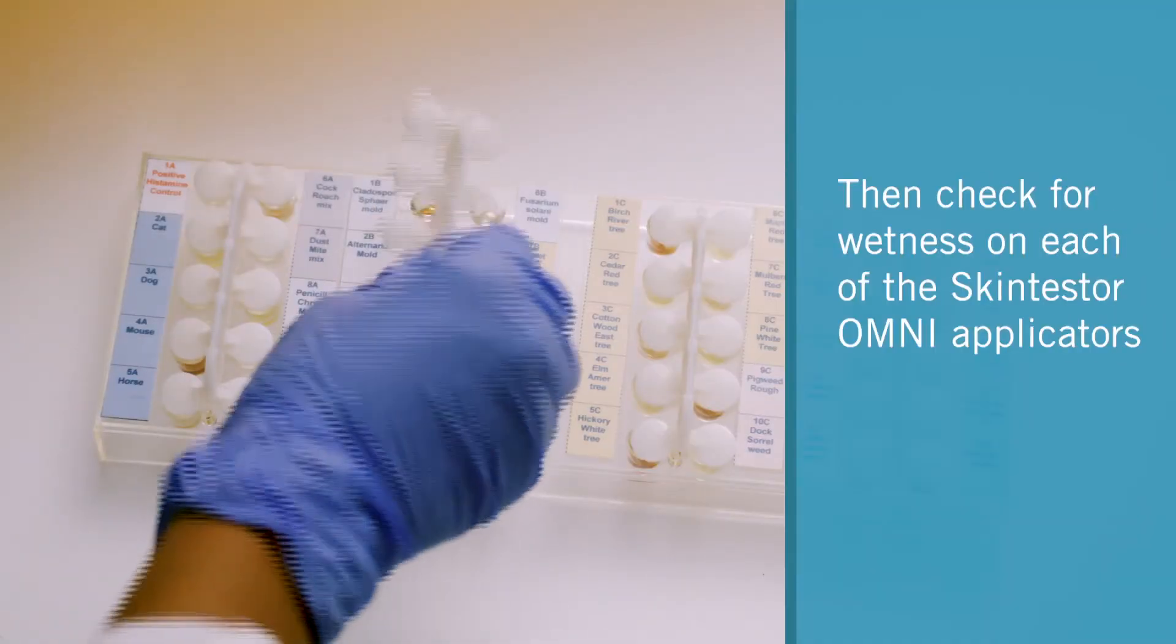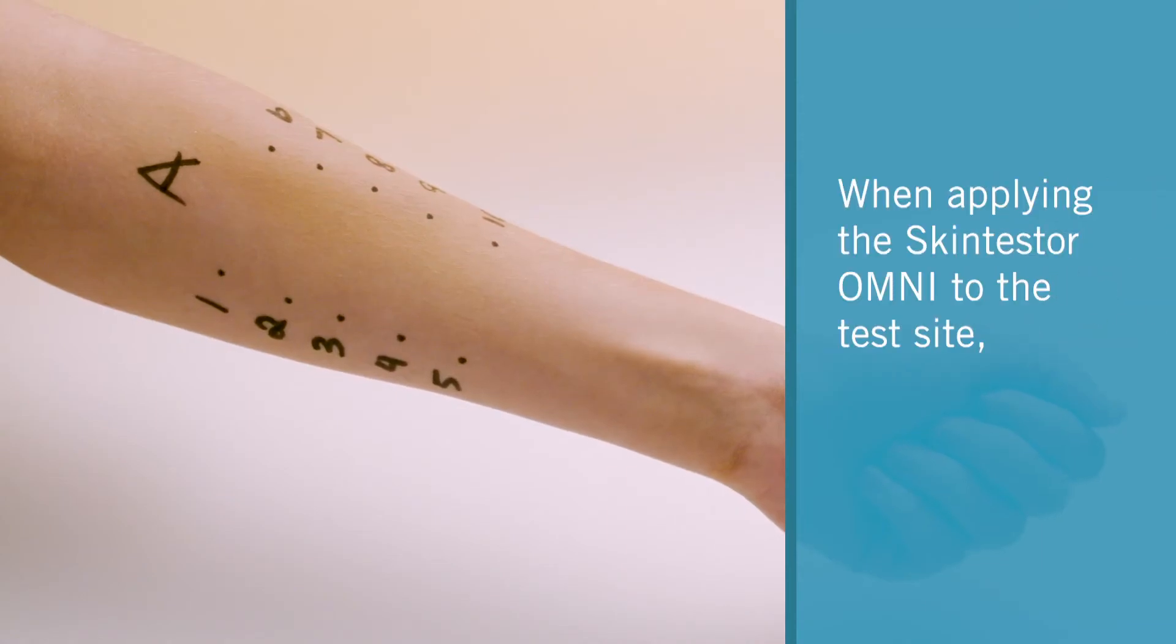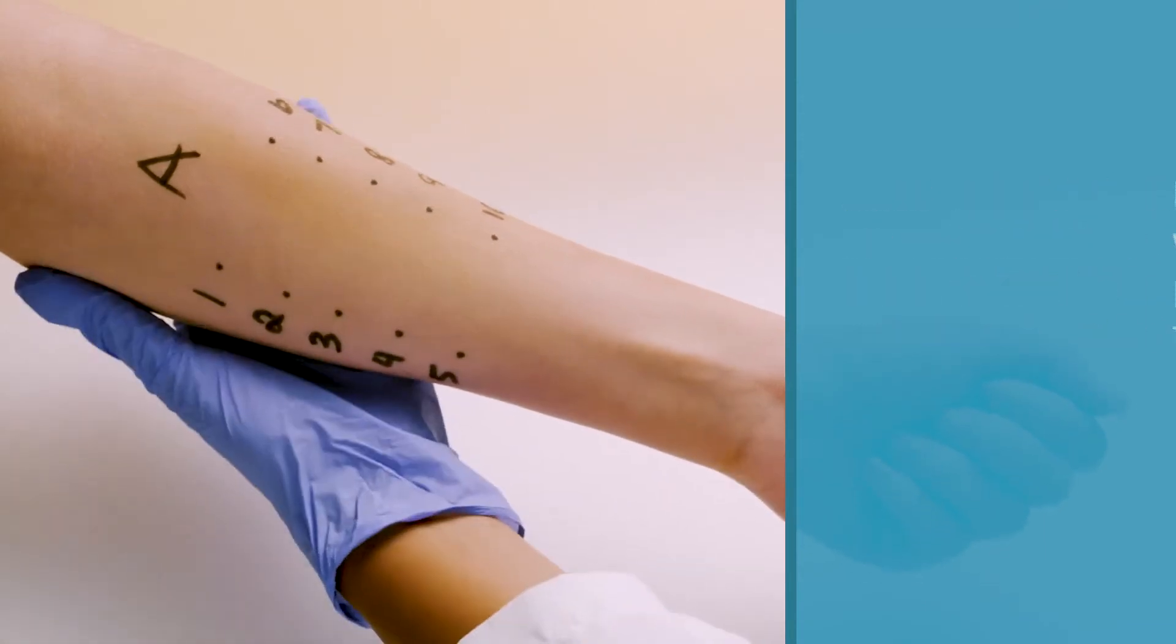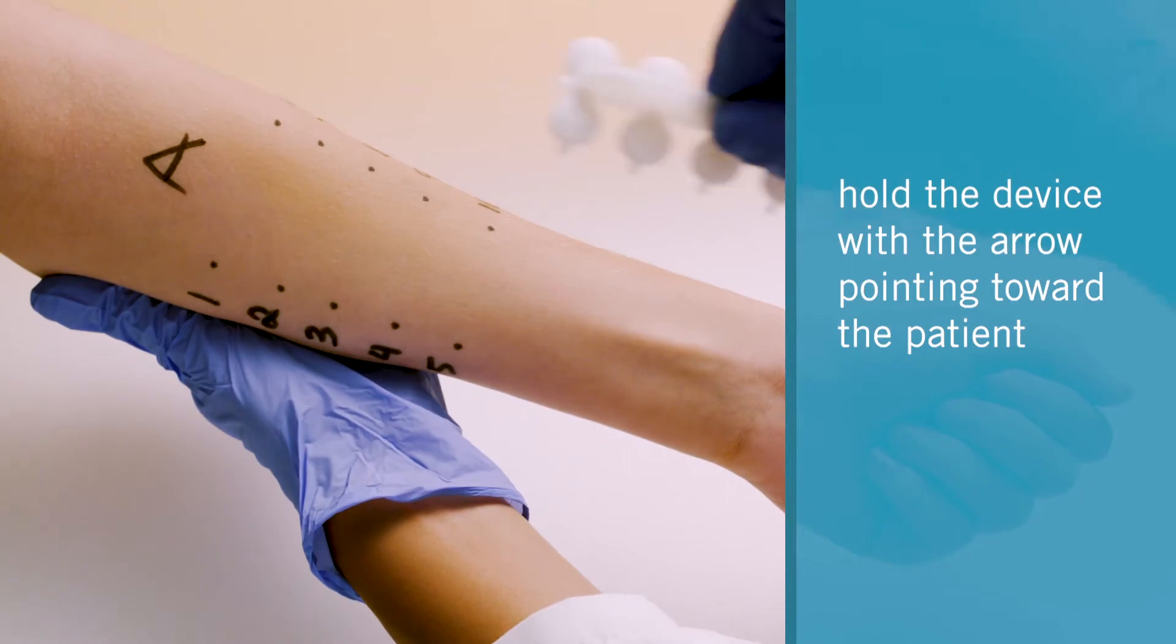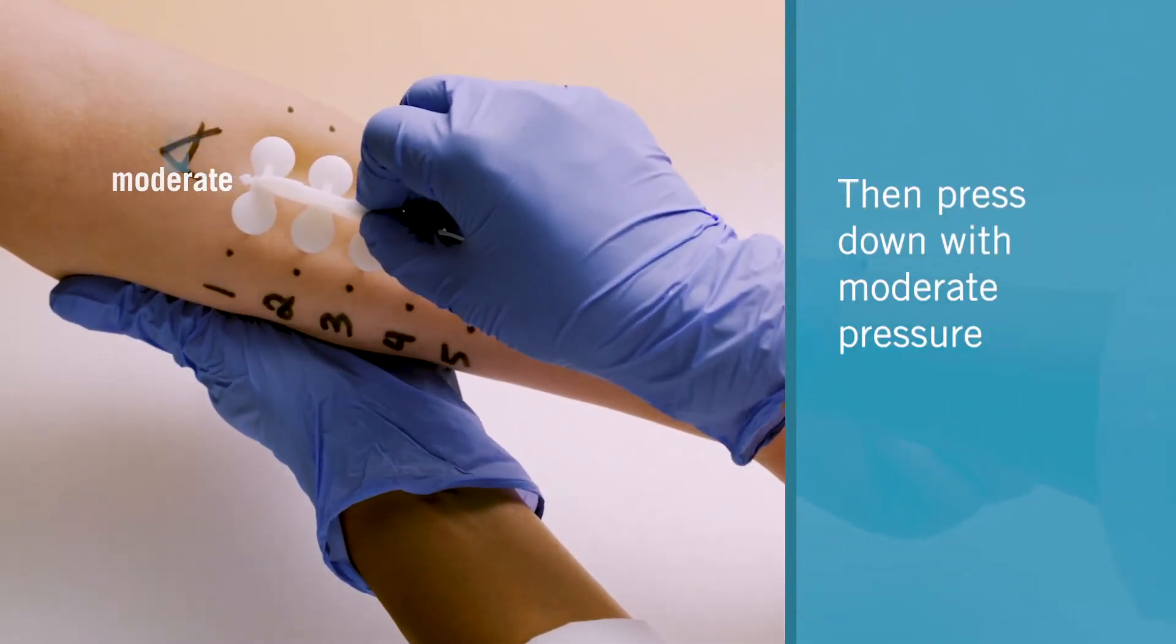Check for wetness on each of the Skin Tester Omni applicators. When applying the Skin Tester Omni to the test site, hold the device with the arrow pointing toward the patient. Then press down with moderate pressure.